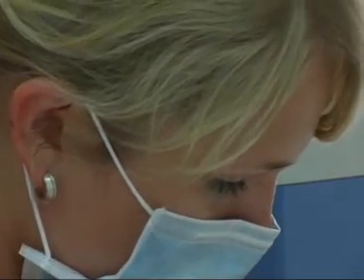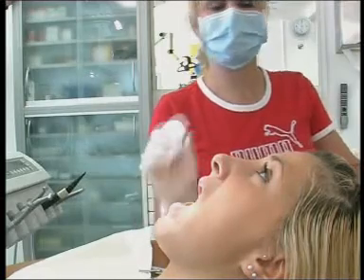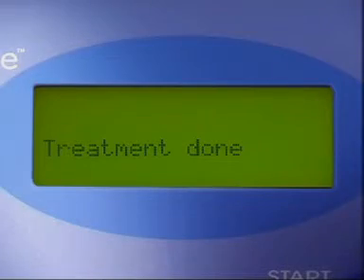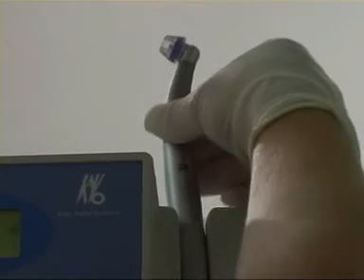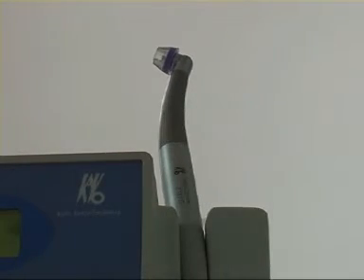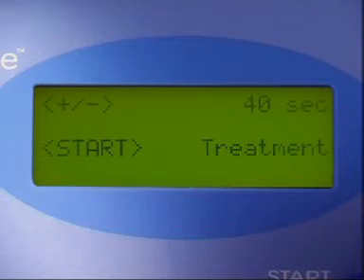A long buzzing tone indicates that the treatment has come to an end. The display shows: Treatment complete. The system then returns to the main menu, ready for the next treatment.